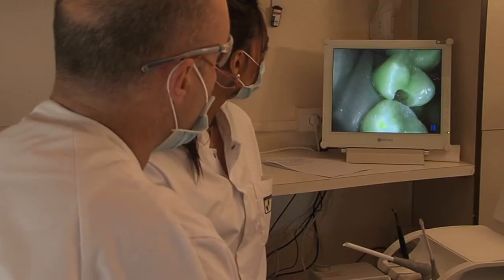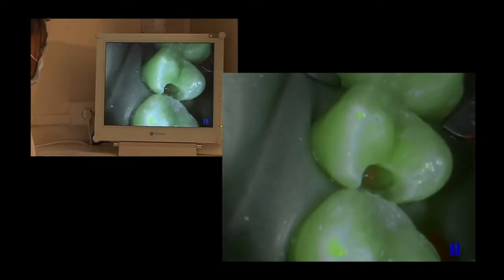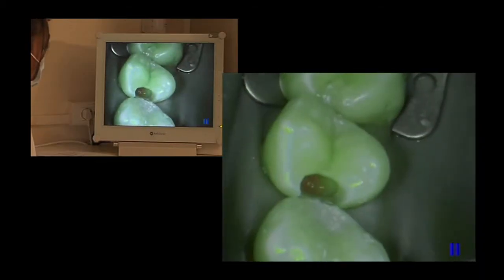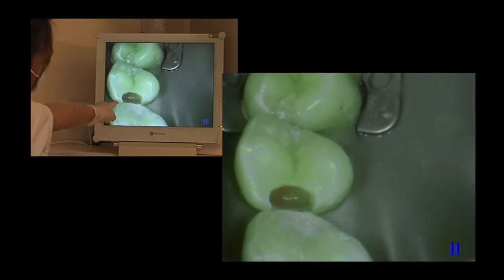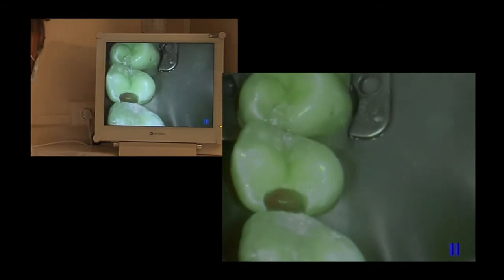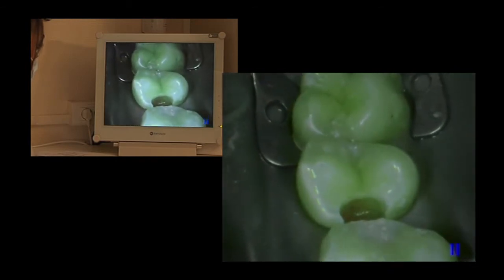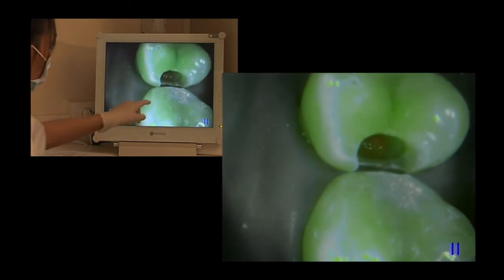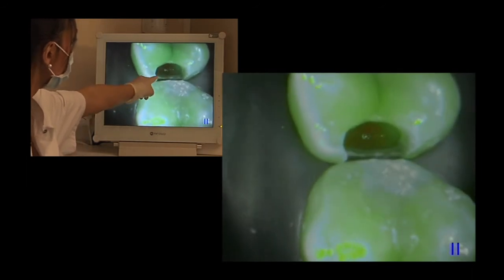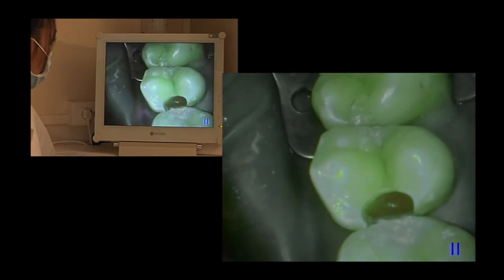We can consider that the preparation is now complete and that the infected tissues have all been removed. It's clear that what we have here, over the greater part of the walls, is a green fluorescence that is less luminous than in the healthy areas of the tooth. The bottom contains a small, slightly red and orange shadow — this is tertiary scar dentine, which will be preserved and which confirms to us that all the infected tissue has been removed.